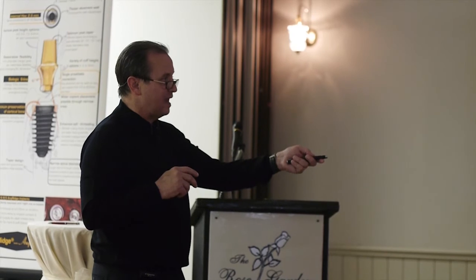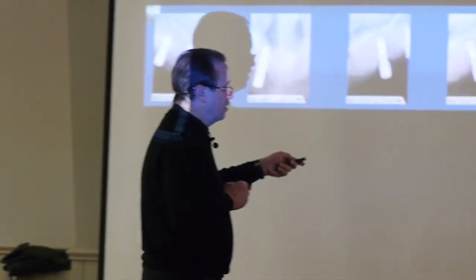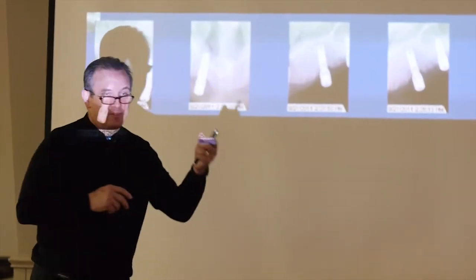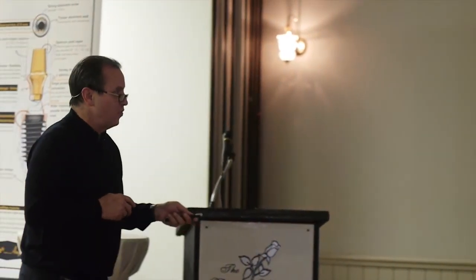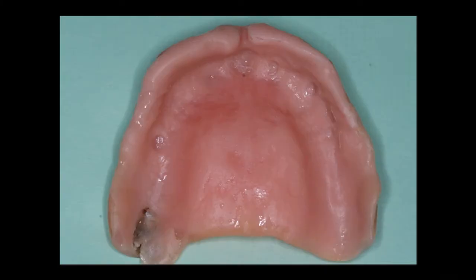By the way, this one fell out. This one lost integration after it had been in function for a while. And it's no wonder. I mean, look at this, D4 bone. We got a little machine screw in there and this real long, what do you call it? Lever. It'd be a long lever. So we went back and replaced that with an AnyRidge implant down the road. But this is what he was wearing.